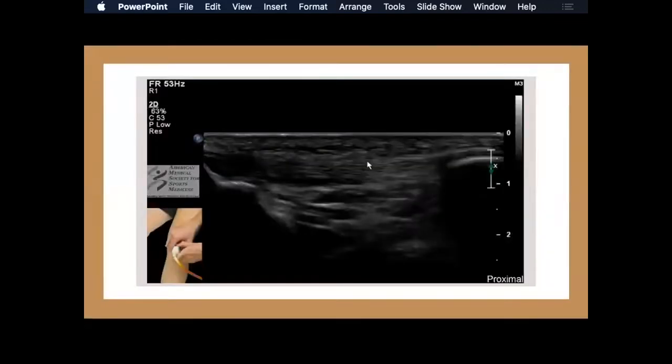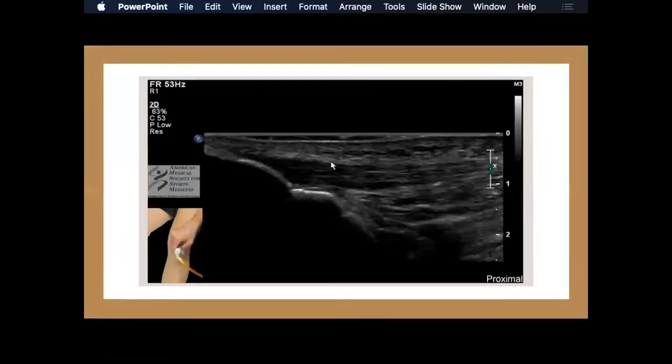So it's pretty easy to do an ultrasound exam of the patellar tendon. You can see that they have a little anisotropy on the left there. On the right patella, left, they're going over to the tibia. And then once they've identified their landmarks, slide more distally to get the tibial tuberosity. And they haven't gotten quite rid of the anisotropy, but you can see it attaching over a nice crisp bone without any big effusion underneath the patellar tendon. Okay, next slide.